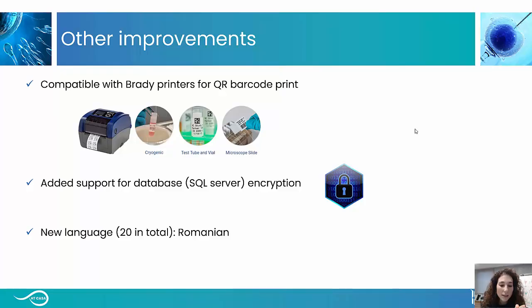Secondly, we find more support for database encryption. This means that now all the data, the patients, etc., are even more encrypted than before. This represents an increase in security, and of course more reason to have software that we can rely on when using it in the lab.